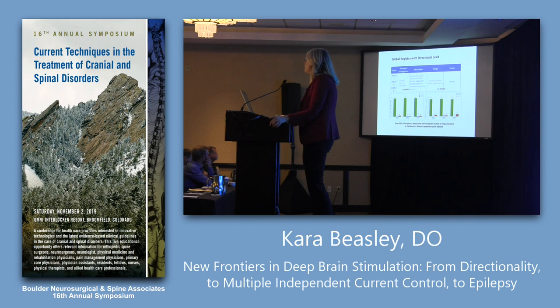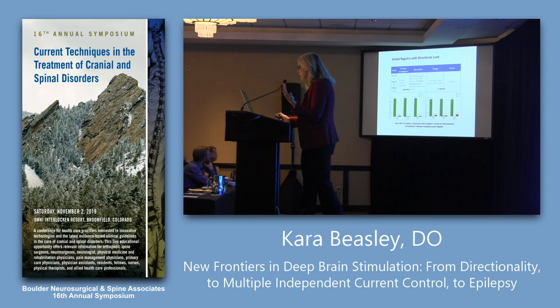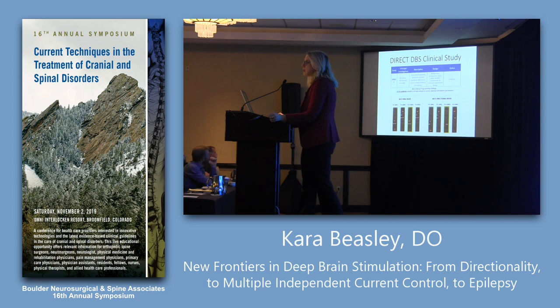And so there's also a global registry, which is really interesting with the directional leads out of Germany. And so what they're doing is looking at the real world outcomes, not just what happens in the study, but once these folks have been implanted, because of course they are implanted in Europe way before they're implanted in the US, do we really get long-term effect with directionality? And so what we see is that the green shows that there's an impact. The blue is a no change, and the red is a worsening. So as we can see, directionality just has marked impact, 95, 97, 94% impact based on subject, clinician, and caregiver responses. So all three of the folks who are involved in directional with Parkinson's show that it makes a difference, and that's ongoing.